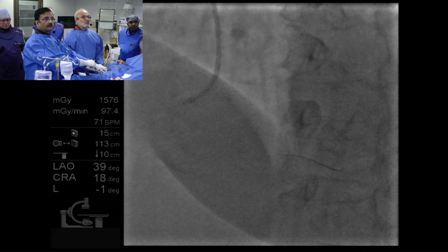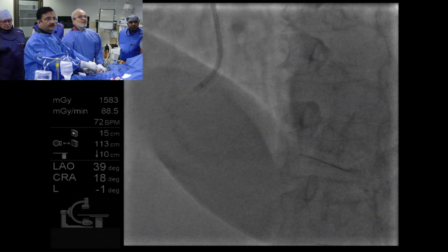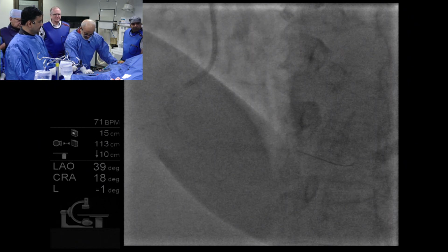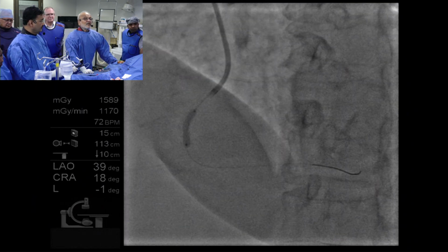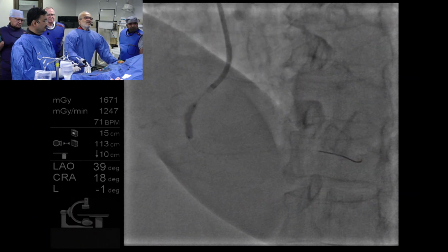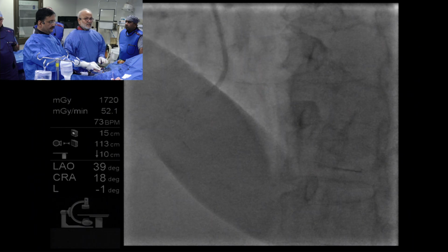Now let us go to the proximal part. A little back. Yes, fine. Okay, fine. Go, 15. It may rupture. It won't. Okay, that's very good. 15, 17, 18. 18. Deflate. Why does the papyrus have to be here? Yeah, deflate. I have deflated.